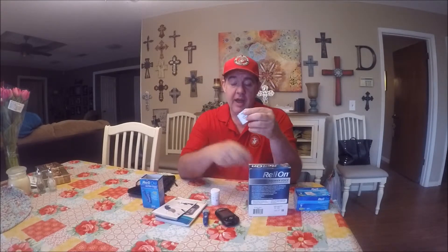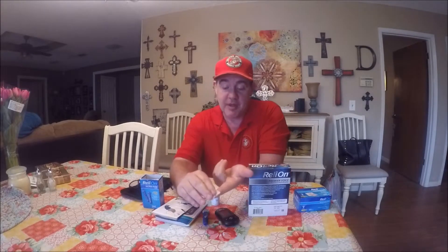I've also got an alcohol wipe. Now, if blood makes you squeamish you might want to look away for about 30 seconds, because I'm gonna prick my finger and we're gonna check this. So what I'm gonna do is clean my finger first.